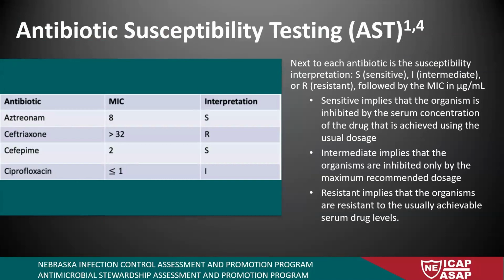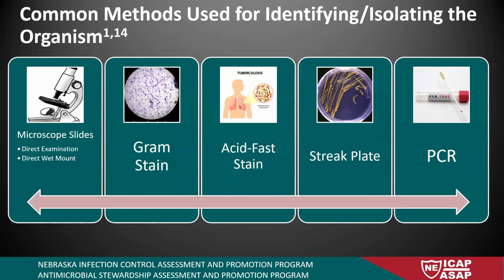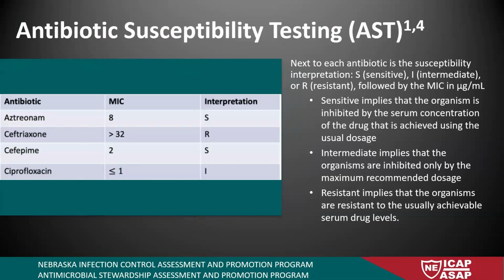I don't think I've ever seen methicillin prescribed. It isn't used anymore, but they do oxacillin. So here's an example of a negative blood culture. I was trying to get negative and positive. Usually blood cultures they let grow for 5 days is the typical, unless they're looking for a fungal culture or something like that. But a typical bacterial blood culture, they'll finalize within 5 days.